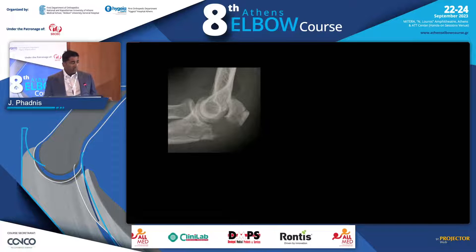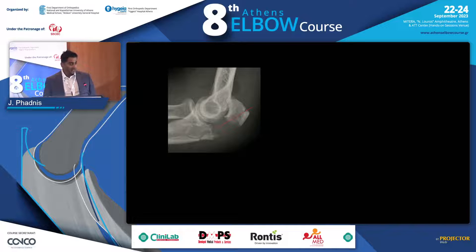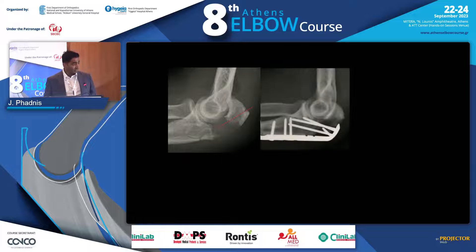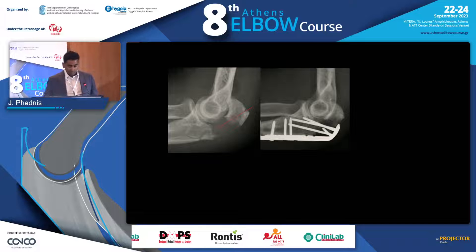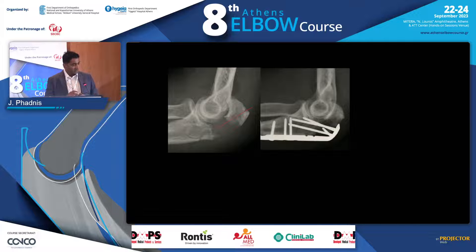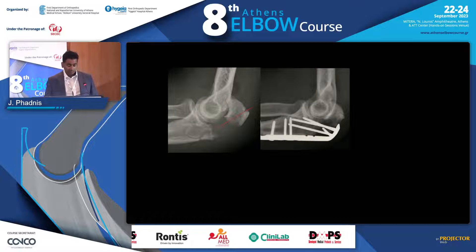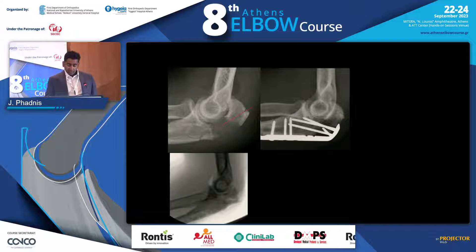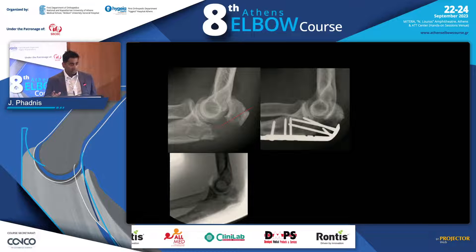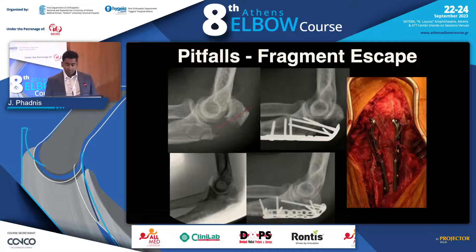Beware of a few things when using a plate. Look at this fracture — there is a very typical hidden fracture line, and frequently screws will be placed through that fracture line, which can displace the fracture. Even when using plates, I use sutures to reduce the fracture and maintain everything, and then the plate to neutralize the triceps. In one revision case, with sutures alone it was perfectly stable — we then added the plate to neutralize because it was revision surgery.